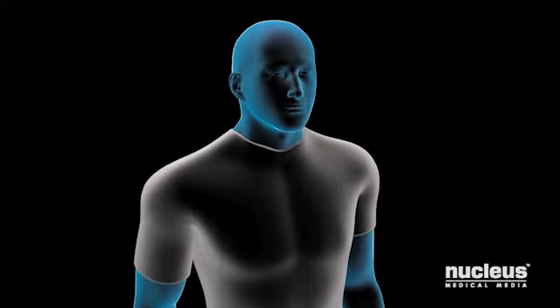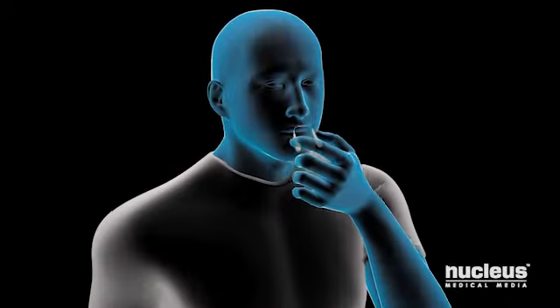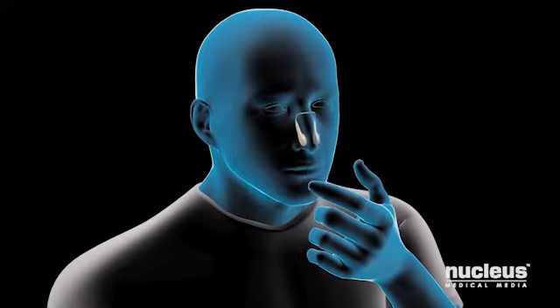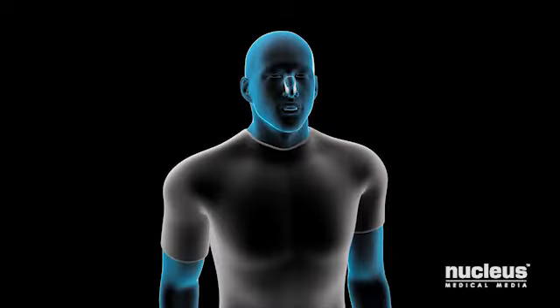To start, you will raise your head and chin so that you can breathe easily. Next, you may place a clip on your nose to prevent air from coming out of your nostrils. Then you will take a deep breath, filling your lungs completely with air, and hold it.